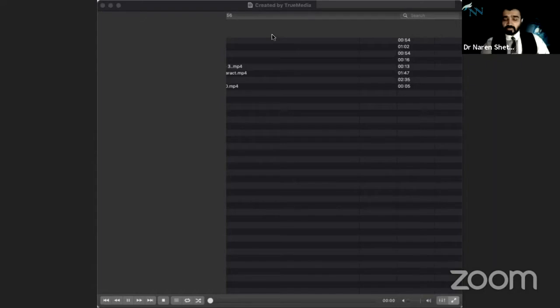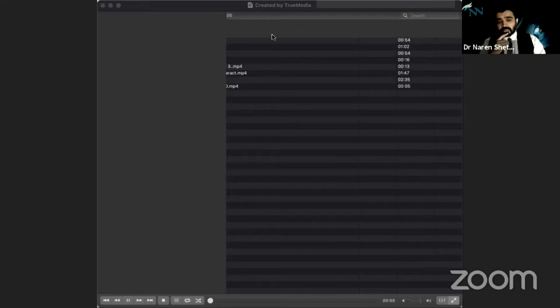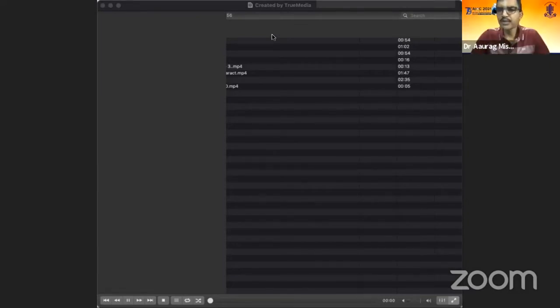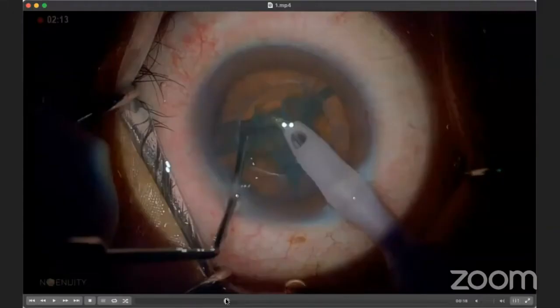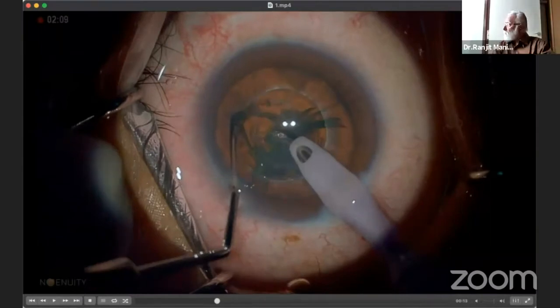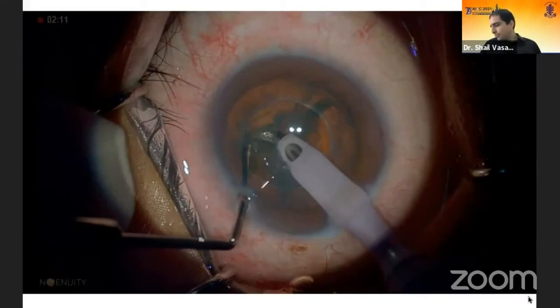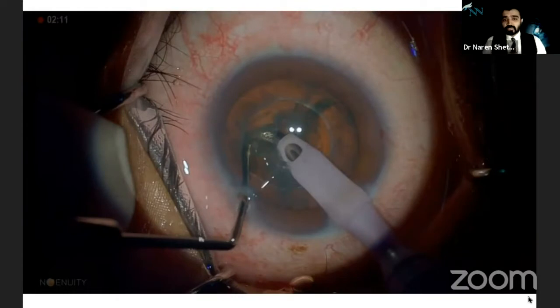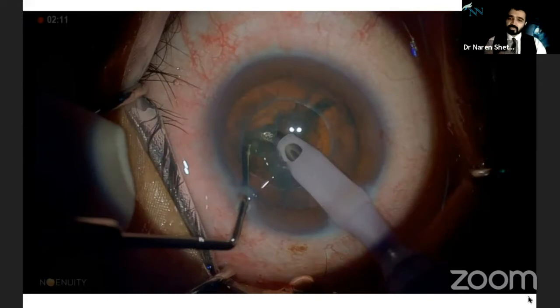You can see me operating on a very soft cataract, and yes, you can do a direct chop in all grades of cataract, even in these soft cases. This is more of a mechanical chop done only under irrigation. The crucial point when doing a direct chop in soft cataract is to do it slowly — if you hurry, it cheesewires and you won't get a perfect separation.